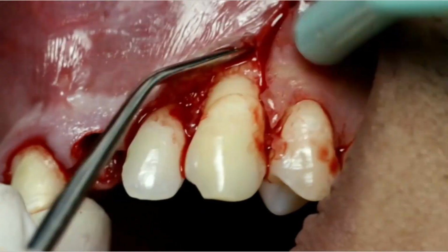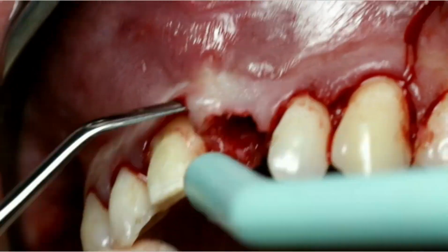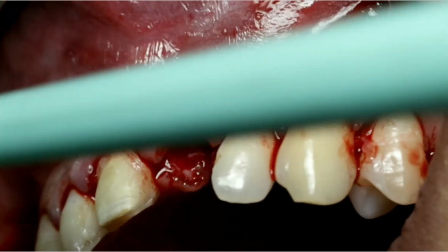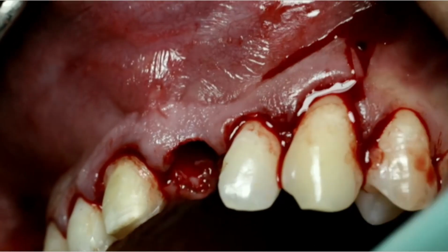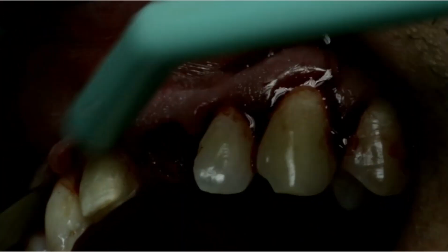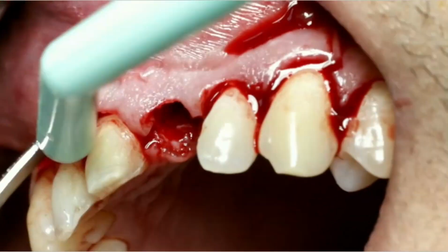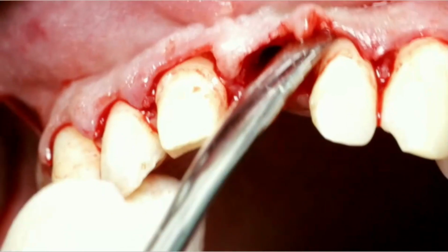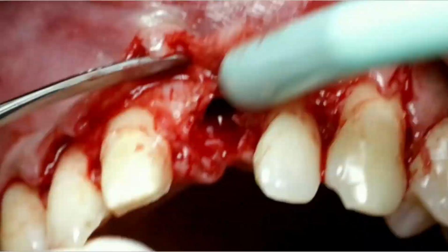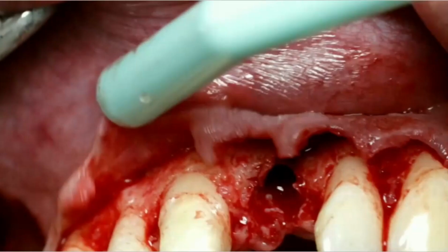Gently reflect the papilla. We start our reflection of the flap.